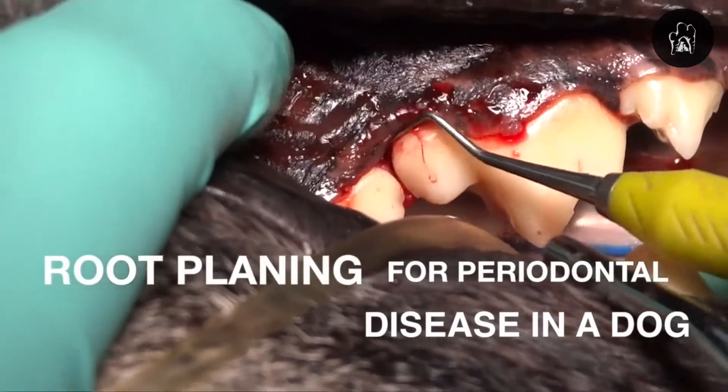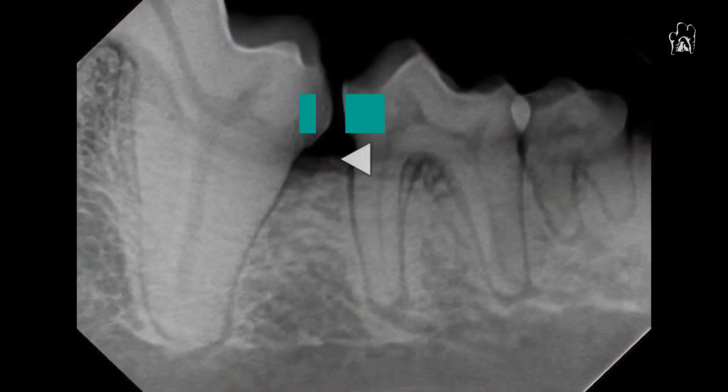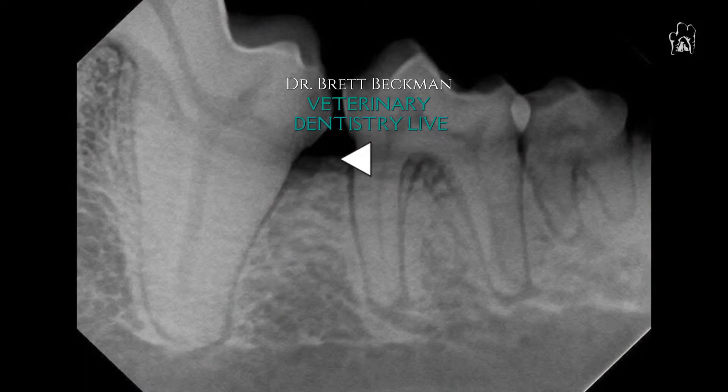In this video, we're going to demonstrate root planing for a very small periodontal defect adjacent to the first molar on the left mandible in this dog. And if you look at that arrow, you can see right adjacent to the distal aspect of that tooth, the bone has a decrease in density that's very minor.